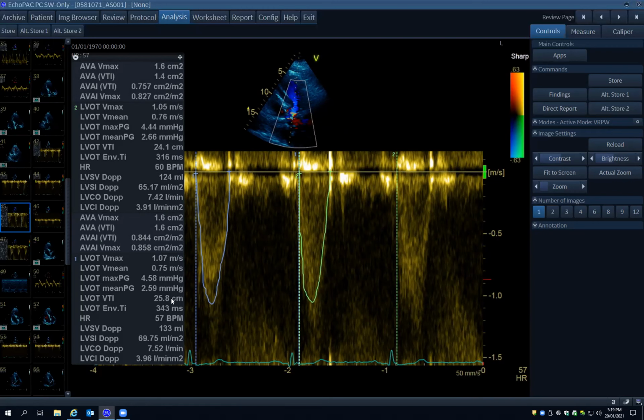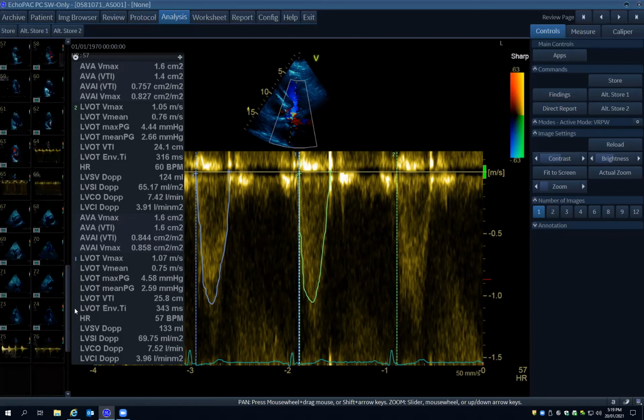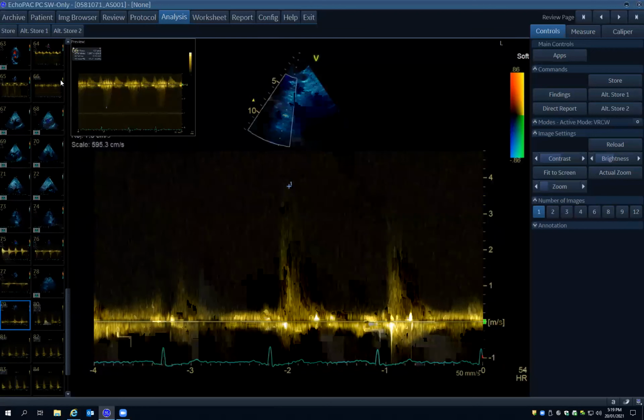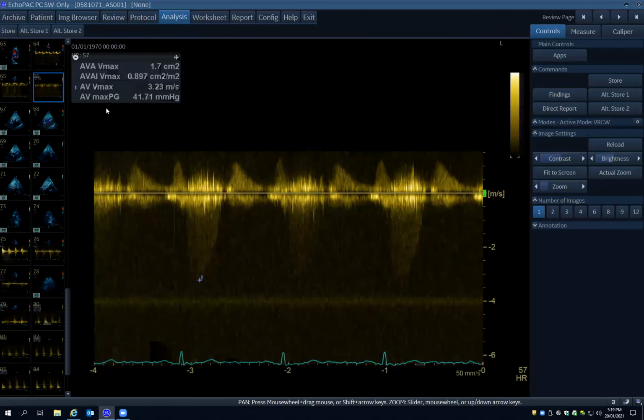Cool. All right, just lastly, the sonographer very nicely did what you were suggesting, which is lucky. And here we've got the first of the uses of the PDOF probe. It's not something that I think I've ever seen a doctor do particularly well, but it's great to see sonographers who often do it very well.